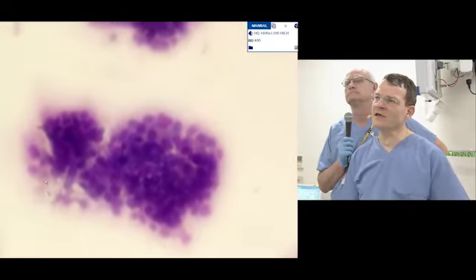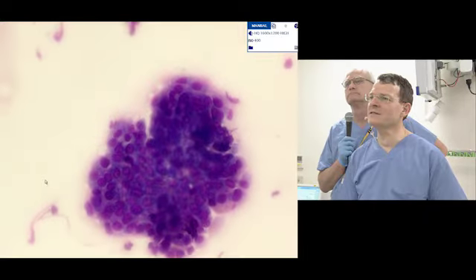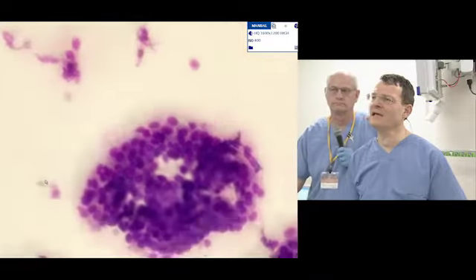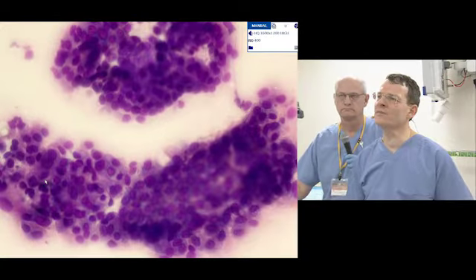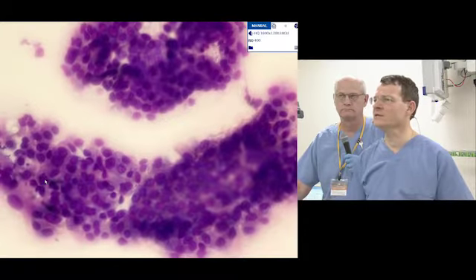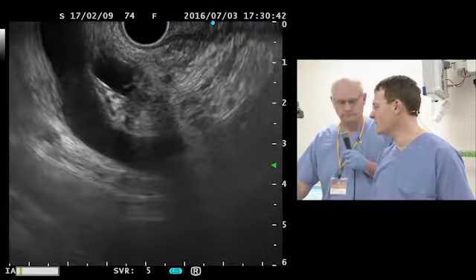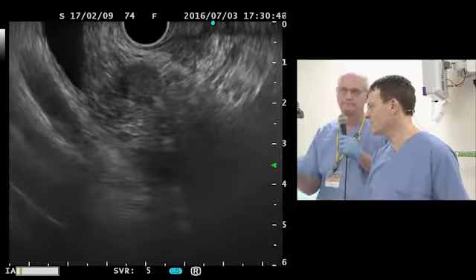What we can say very clearly here is that this 1 centimeter lesion in the area of the pancreatic head has no connection to the portal vein system. The patient is a candidate for surgery. There are no signs of vessel infiltration.